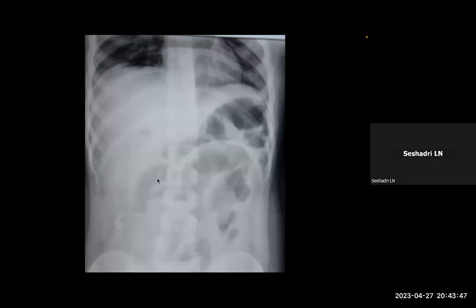Sir, it looks like small bowel, jejunal as well as ileal loops, sir. Oh yeah, both are seen. There are some which are featureless and some which have valvulae conniventes. So you must specify. It says that you're looking for detail. Yes. Okay, sir. And then in the right iliac fossa, sir, there appears to be a calcific focus or some focus, sir, in the right iliac fossa. Yes. Good.